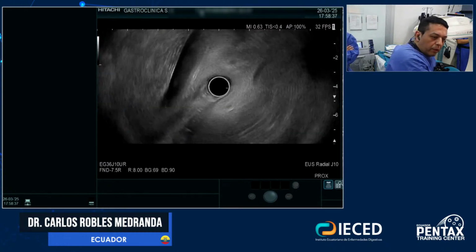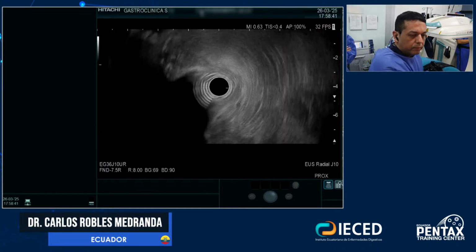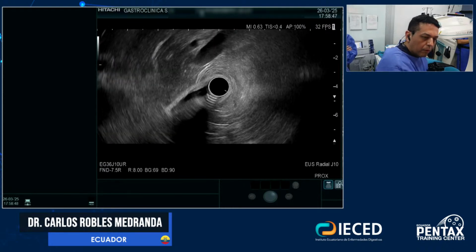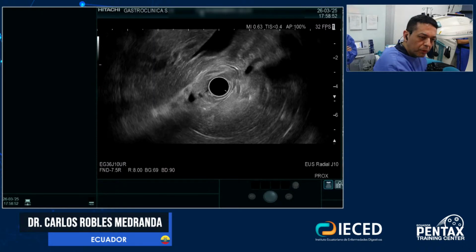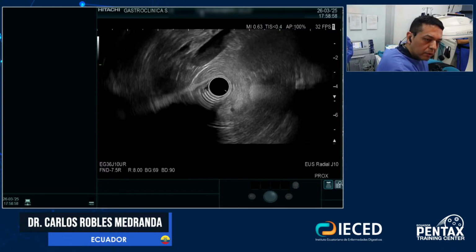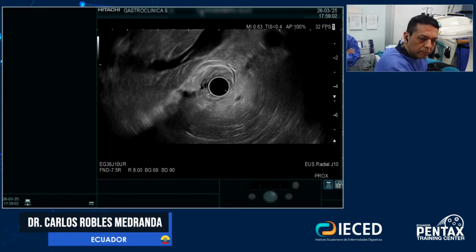So I want to see the uncinate process of the pancreas. I don't see any alteration for the moment, so I'm okay.